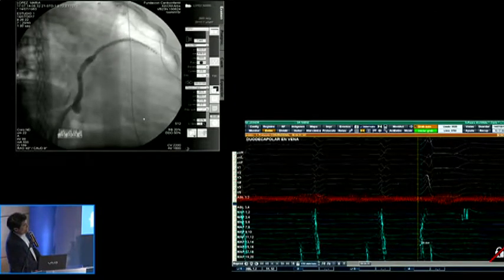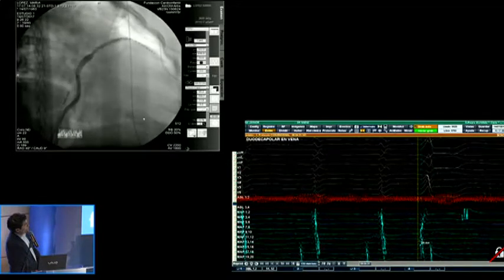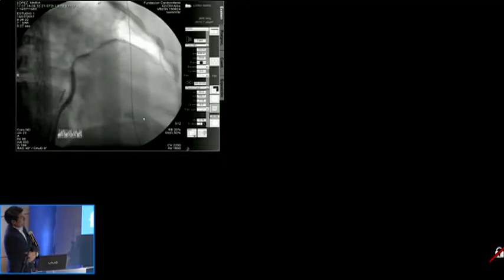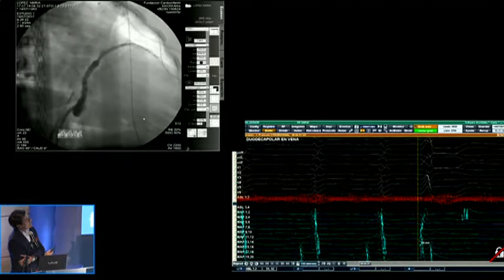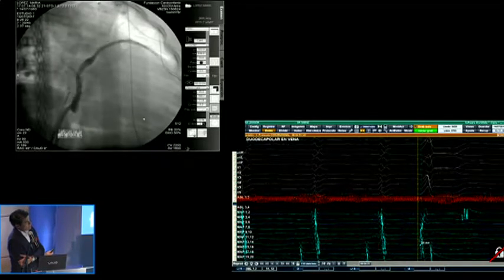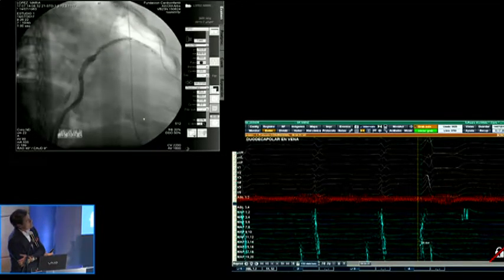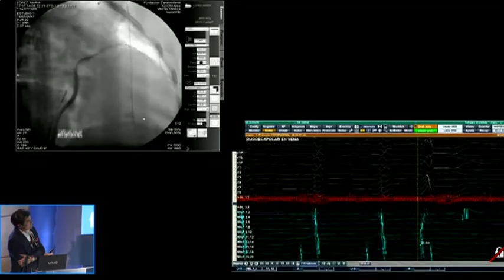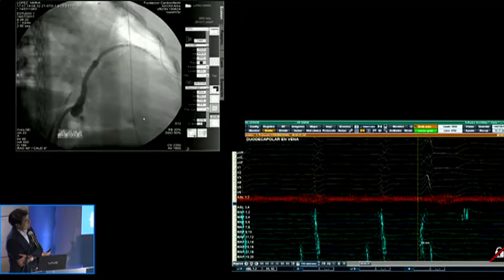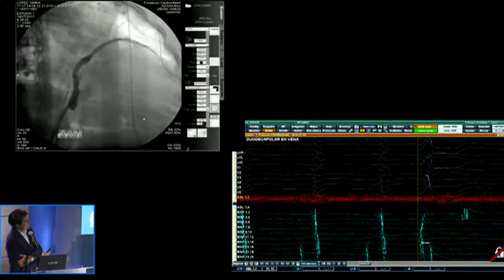So we did a pace map. I won't spend any time on these, and I will ask Miguel to explain the vein, but the pace map gave us 93%, 95%. So we know from here that in order to find something better than this, it will be very difficult. And we are beginning to think about the approach to do the lesion. In any case, the second step, and that's what Miguel is talking about, is to say, well, there is a third dimension: endocardium, epicardium, and intramural.